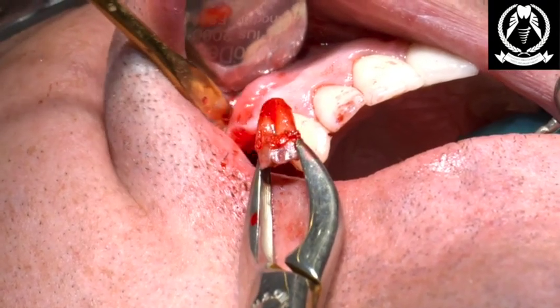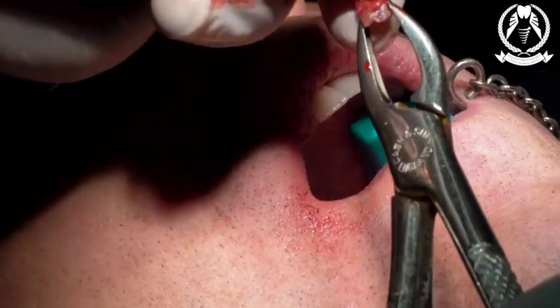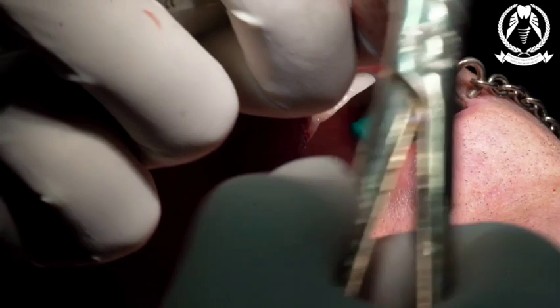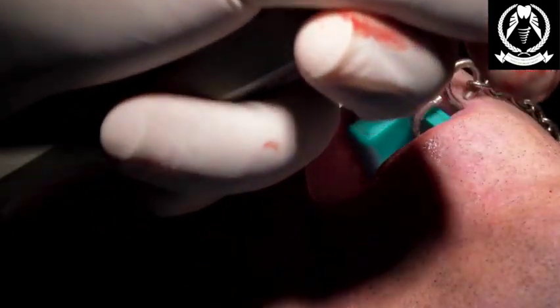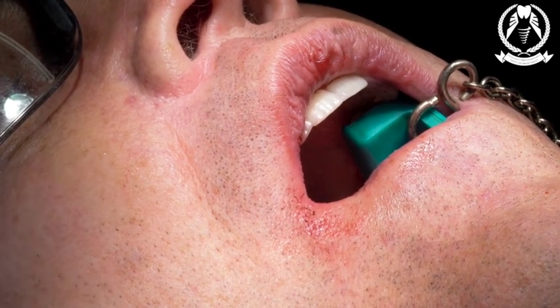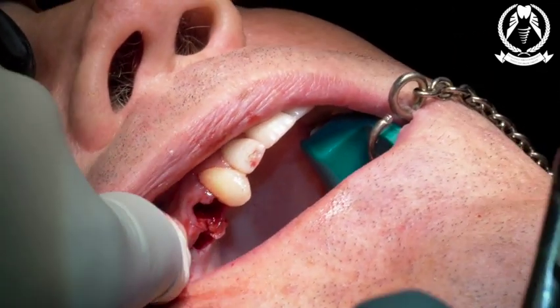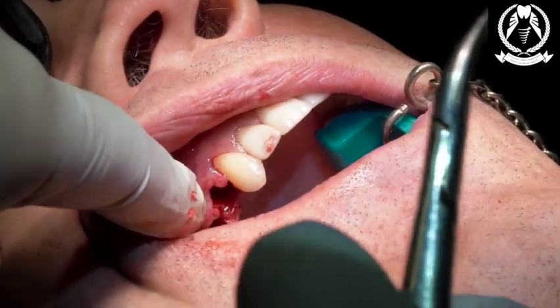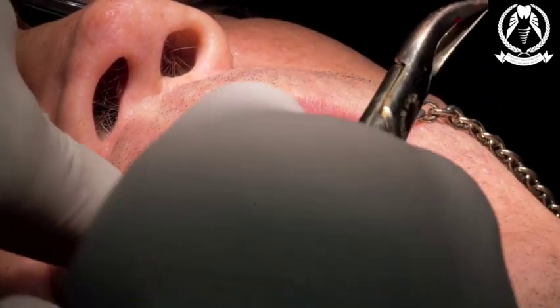So typically the difficulty of these sort of extractions is when you've got a very heavily root-filled premolar tooth. Obviously it just cracks. There's not enough structural integrity to really grab hold of. So you just need time and patience. It's just dropped, and you can get it out. So what we're going to do now, we've kept all the buccal plate, everything intact here. So we're going to get the patient ready for an implant to be placed in the fore area and a sinus lift going in the back there.